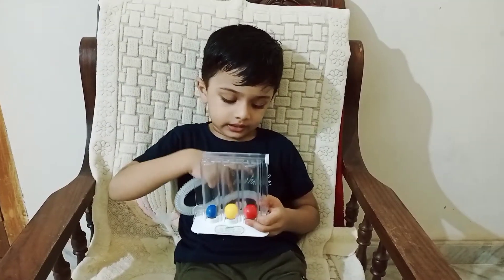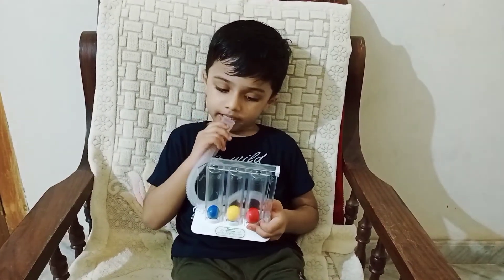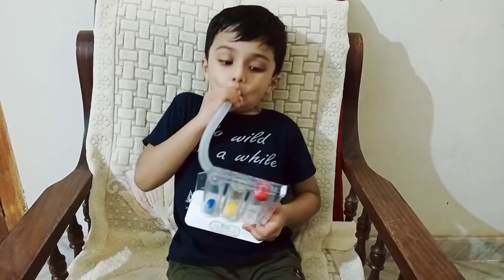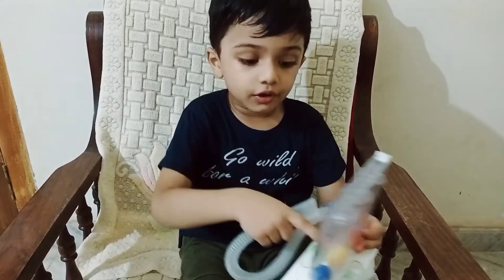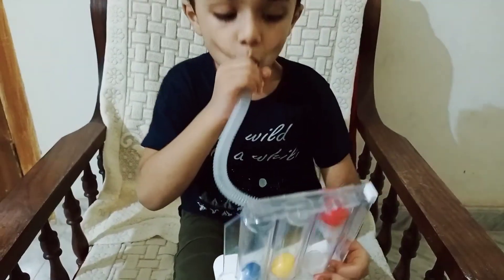We need to use these tools. We didn't use this tool. We bought this tool for the red ball. This one is here. Do you have any tools?